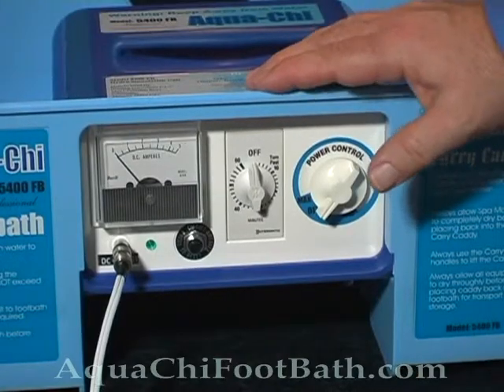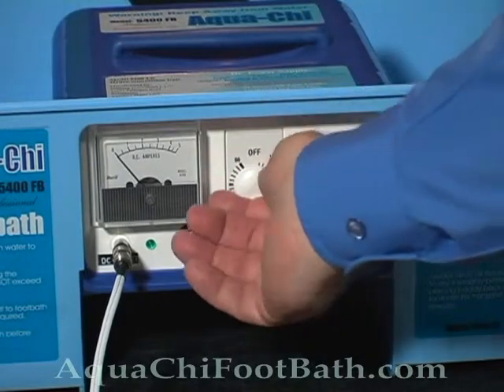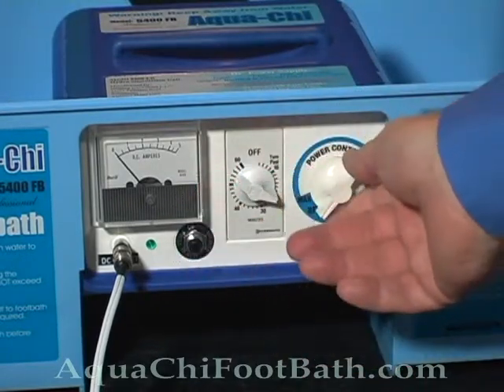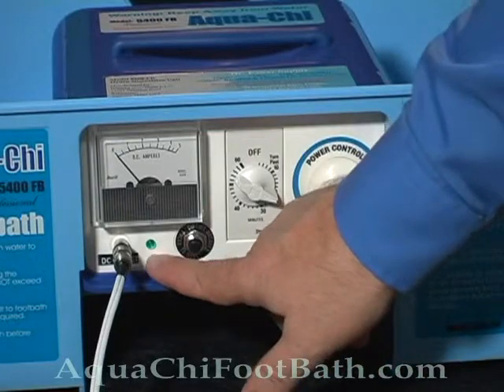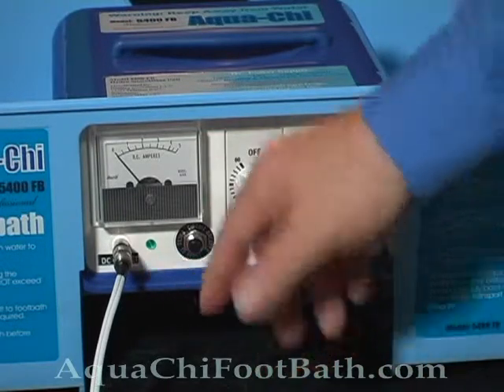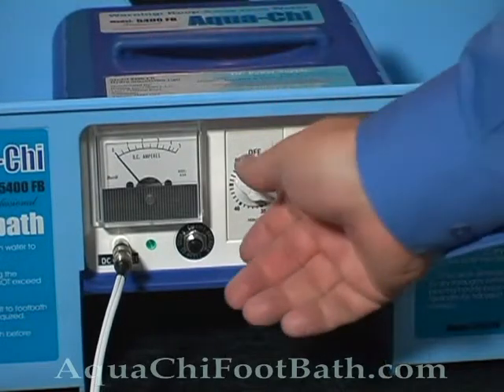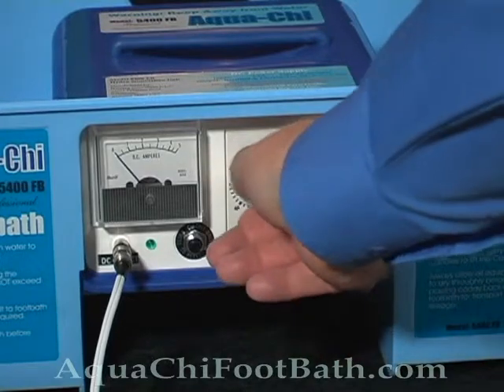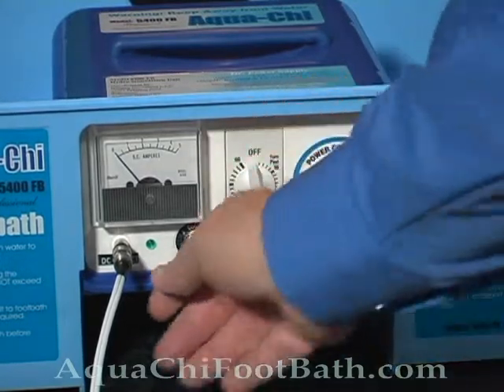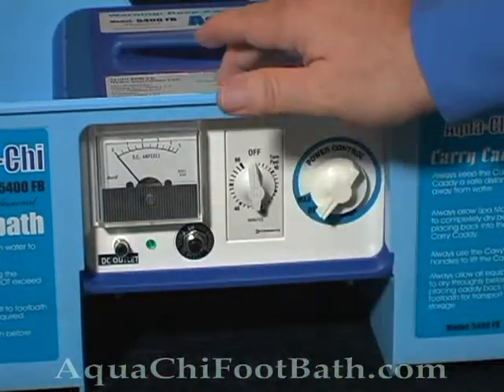Once you've checked to make sure that the power cables are properly connected, turn the timer back on and turn the power control to max. If your green light comes on, everything is fine. If it doesn't, we're going to have to run a test on the power pack. Now the first thing to do is to turn the power control back off and turn the timer off and disconnect the DC cable. Now we're going to change the fuses.